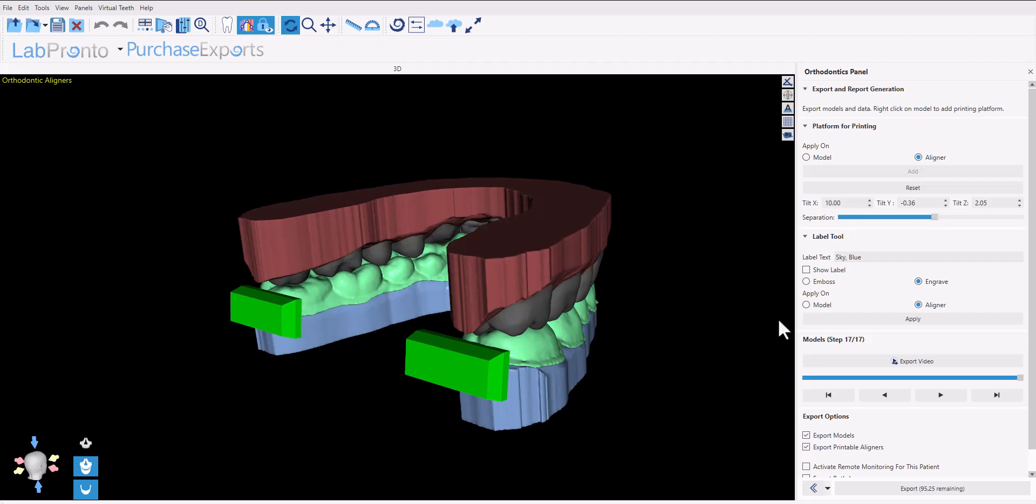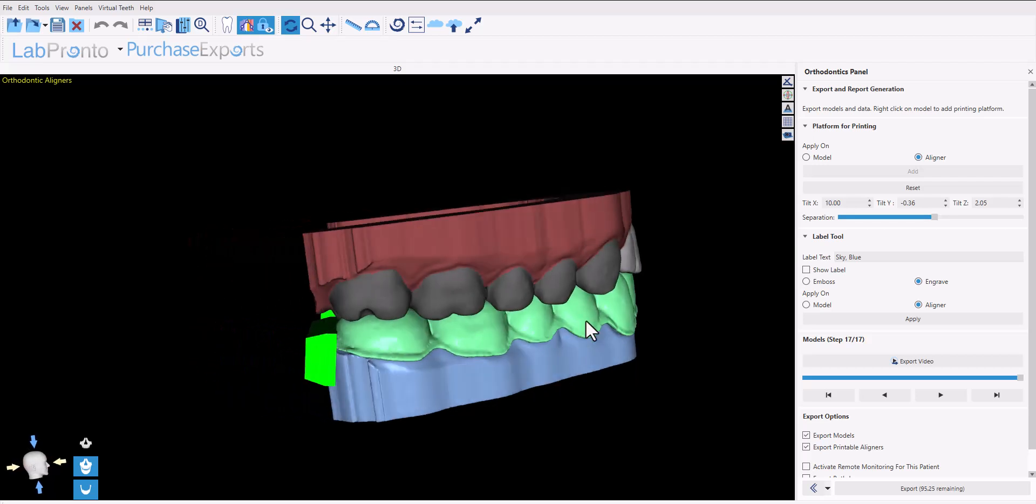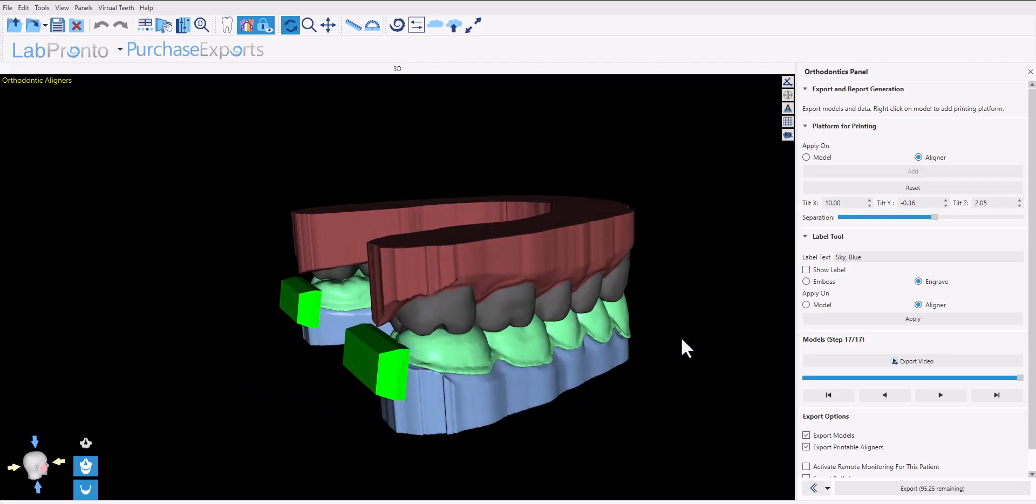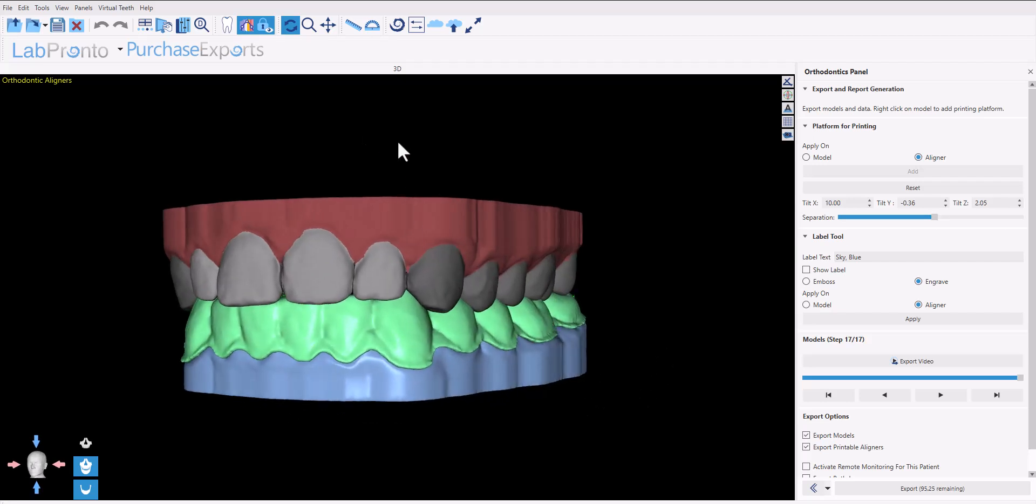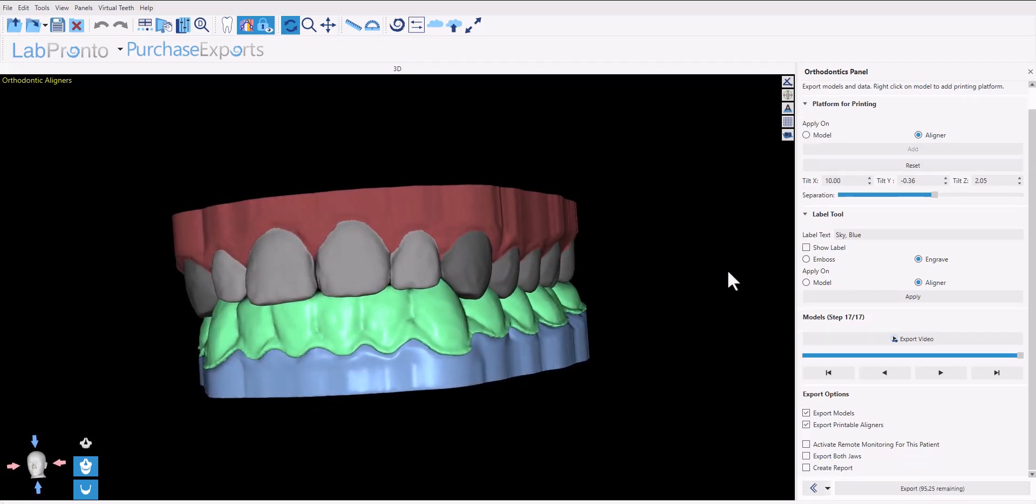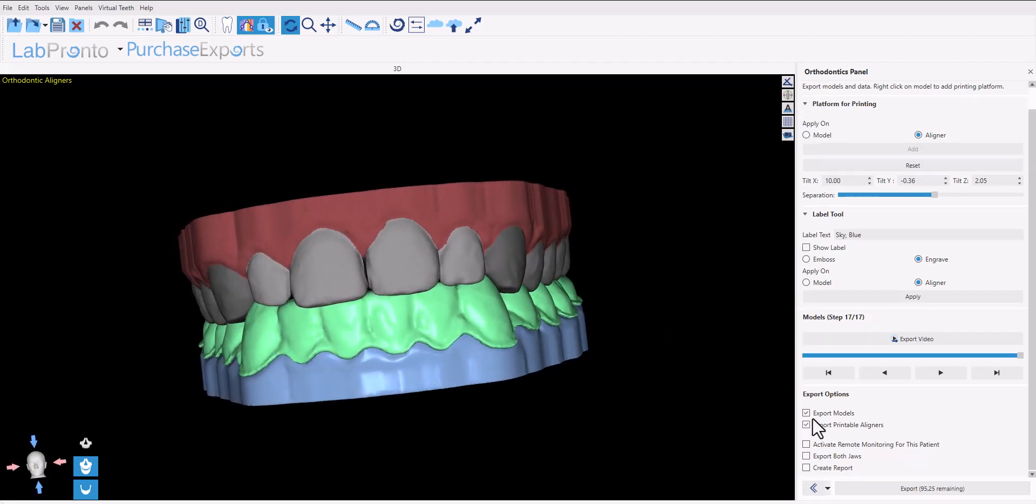Of course, whatever label or platform you add to the aligner on screen, the update will take place and be added to all the aligners in the set. Once you finalize the aligners and the models, go to the export options.